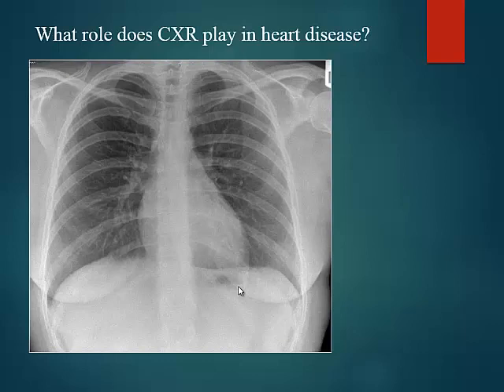Okay, other uses you may think of? In which other situation would you use a chest X-ray? Putting a device. After putting a pacemaker or an ICD, you want to check the position of the leads, you want to check for any complications. That's an important indication for which chest X-ray is mandatory. Patients with chest pain.